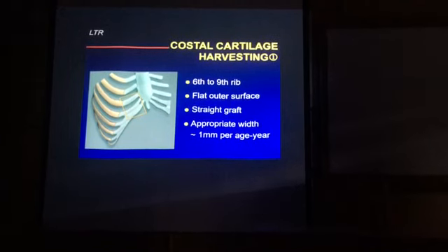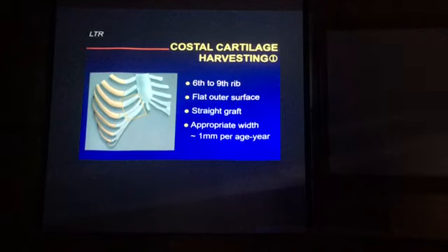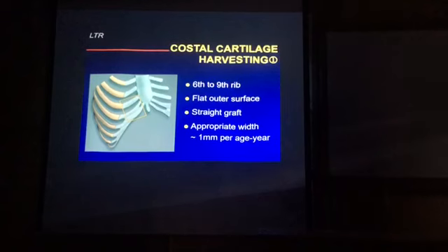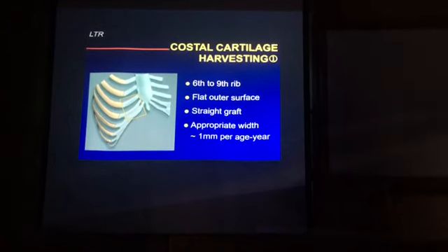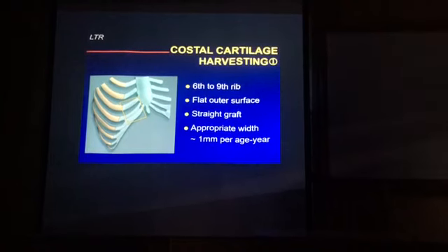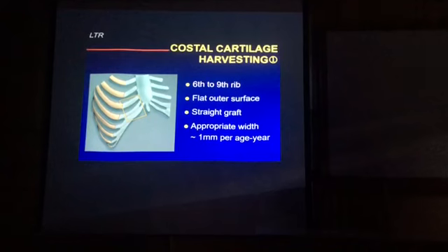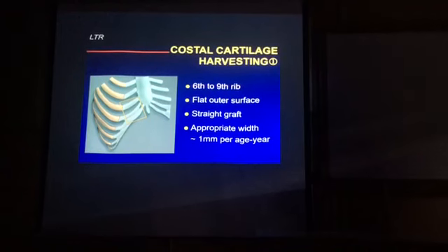Yeah. For instance, the first case that you saw, congenital webbing of the vocal cord, the very long webbing of the vocal cord with a tiny residual opening, I do my laryngofissure from cranial to caudal. So what I do, I transect vertically the petiole of the epiglottis at the notch of the thyroid cartilage. I do a very meticulous hemostasis because I want to see well, and then I use 2 skin hooks, and I try to open the airway.